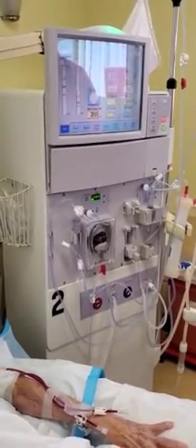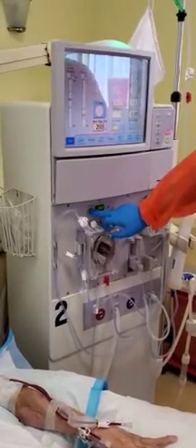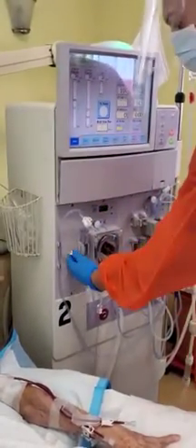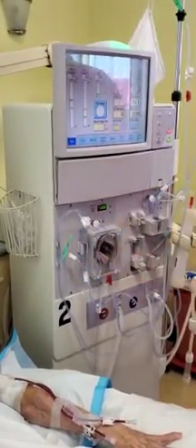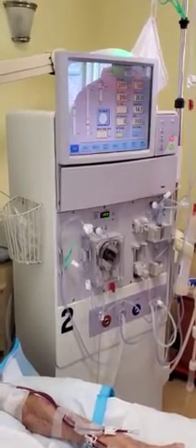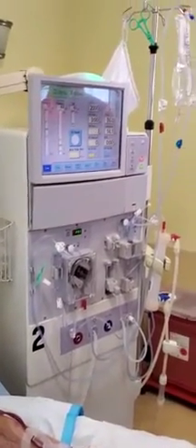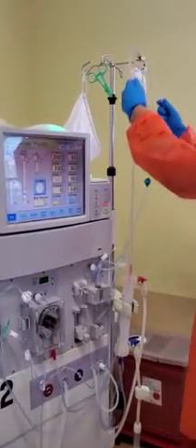He's going to go ahead and stop the blood pump, and he's going to put the clamp — the small white clamp — on the saline line, and also clamp with an additional safety clamp as he did. Now he's going to get his blood lines from the machine.